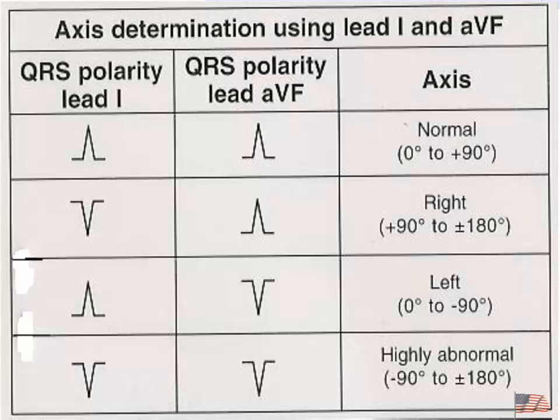So what we'll see is lead 1 being a positive QRS complex, but not lead AVF. It's up and towards the left. Left to right, bottom to top. No man's land. It's got nothing. It's negative all the time, no matter which lead you look in. So lead 1's downward deflection, lead AVF is a downward deflection.